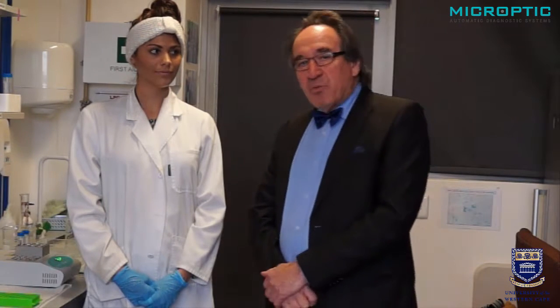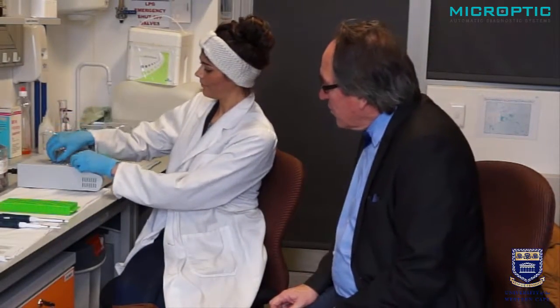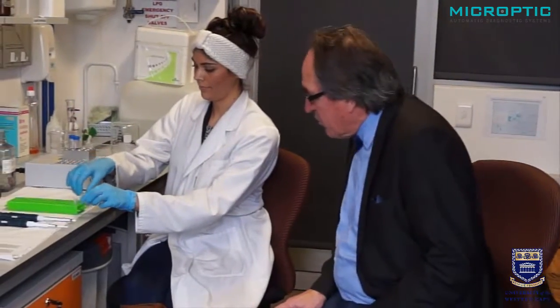We will now demonstrate this very important technique stepwise, showing all the different steps. First of all, we prepare two Eppendorf tubes.